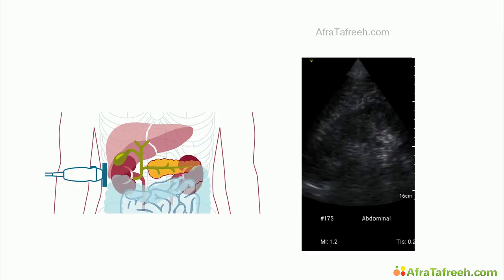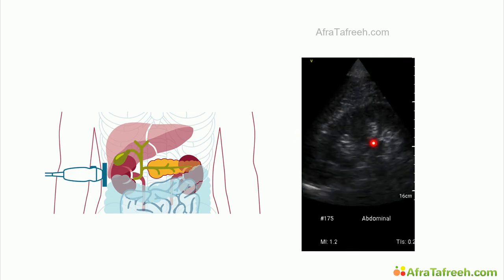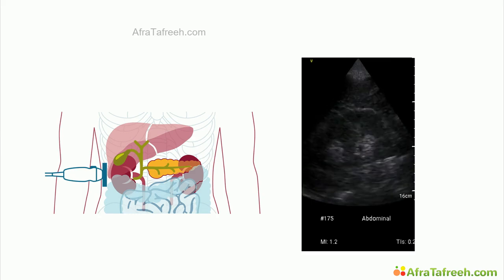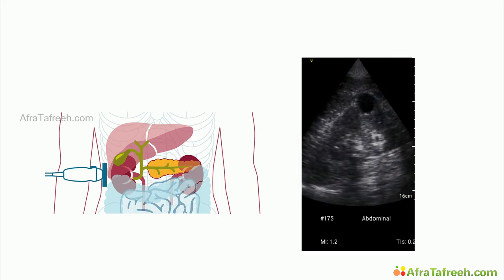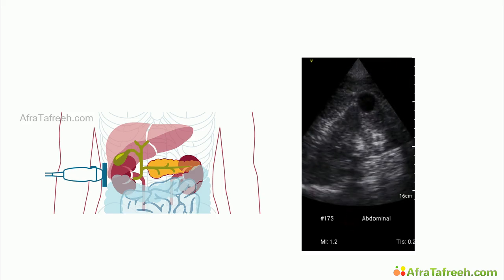Here you can see a longitudinal plane of the right kidney, in the center the renal pelvis, and here you can see the renal parenchyma. I could not find any signs of pyelonephritis, no stone or a dilatation of the renal pelvis. Actually, I found a simple cyst, this echo-free area over here with the dorsal acoustic enhancement.